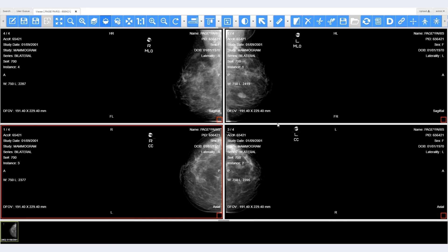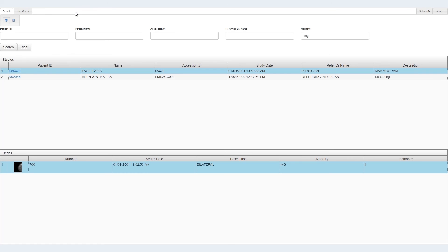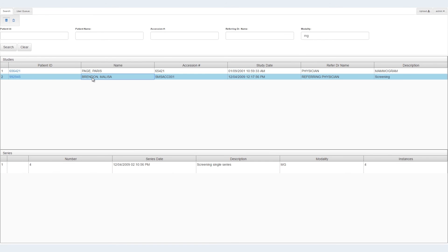Now that a hanging protocol has been created, the user can right-click on any study from any patient matching the hanging protocol's criteria and display the 4 images as configured.